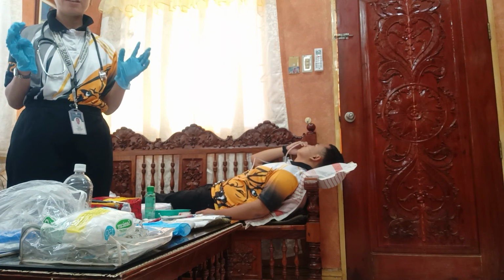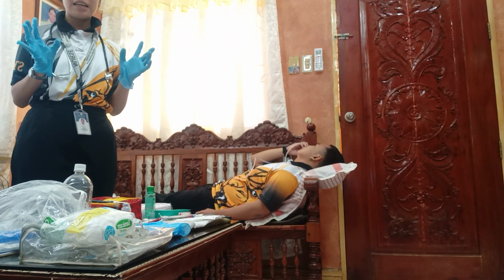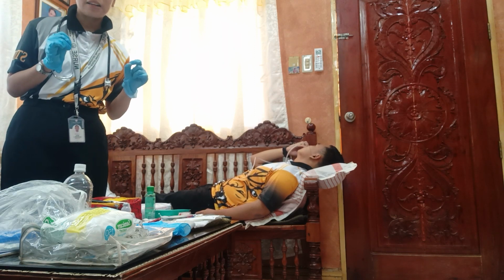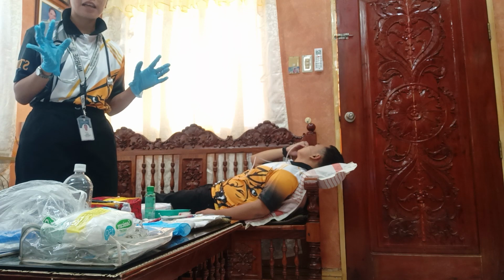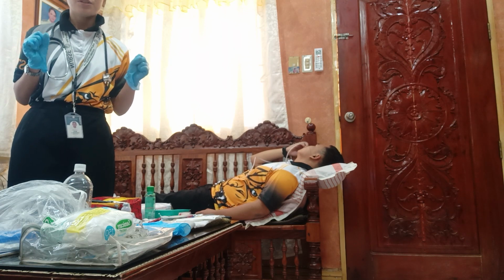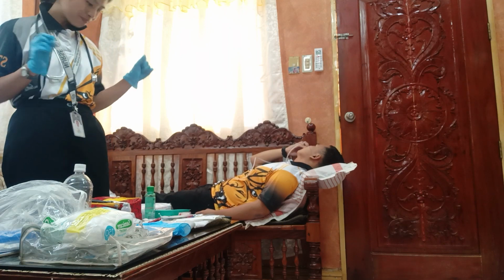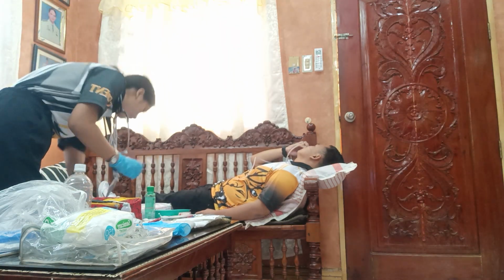Secure the tube loosely to the nose or cheek until it is determined that the tube is in the patient's stomach. So, yung securing po na yon with the tape is temporary until the position of the tube is being determined. And also, gamitin ko po siya.